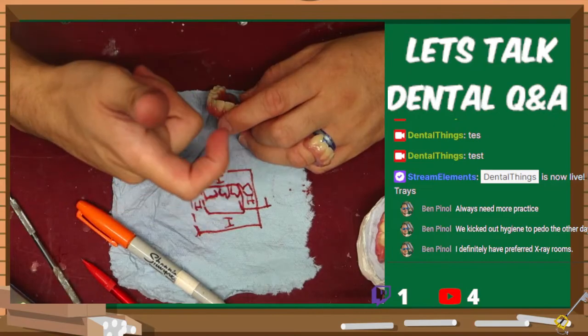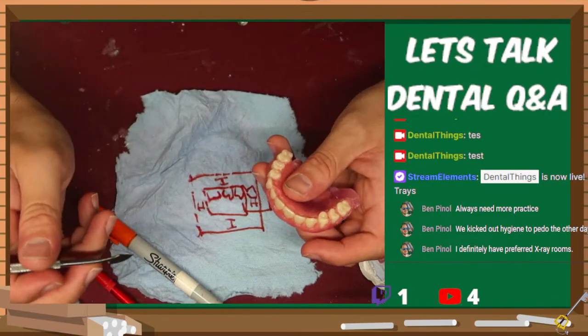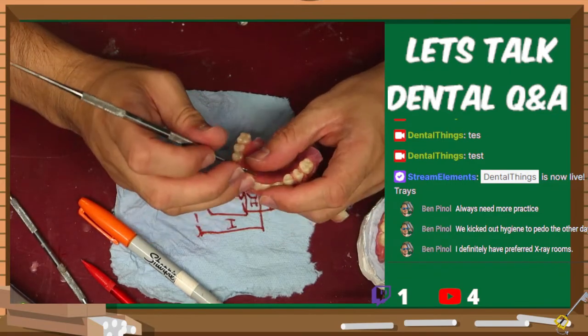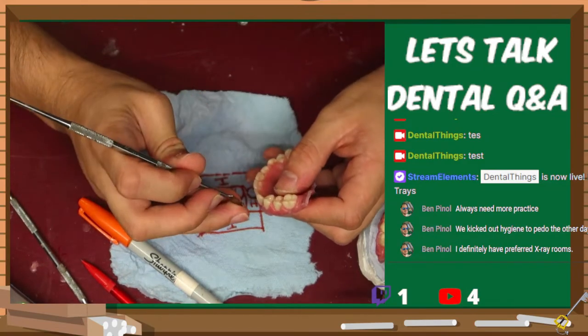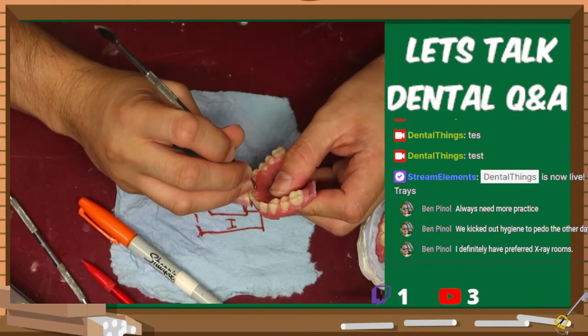I like having the little Nomads, the little portable X-ray units. Those tend to be pretty fun. But also, just having X-ray heads in the room. I don't need that flame anymore. Those are always nice to just be able to have also. But it's just more expensive that way. I know their song and dance. I've lived it.